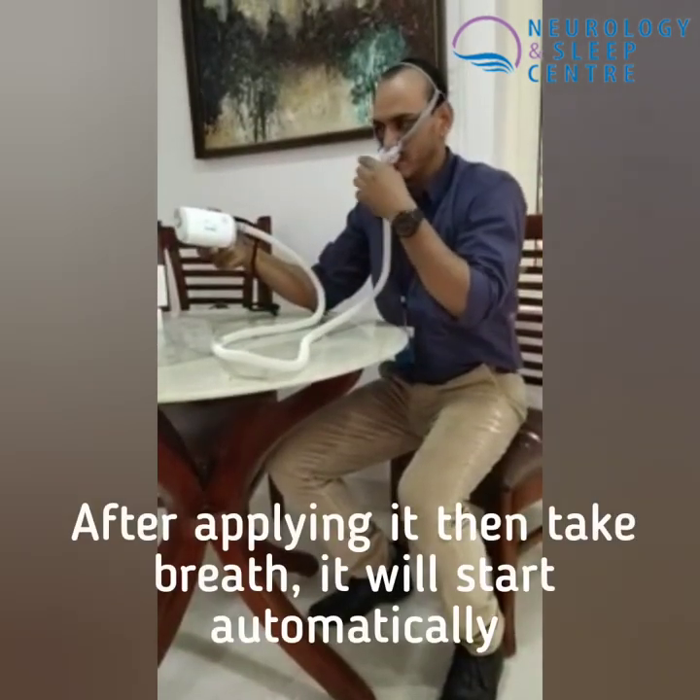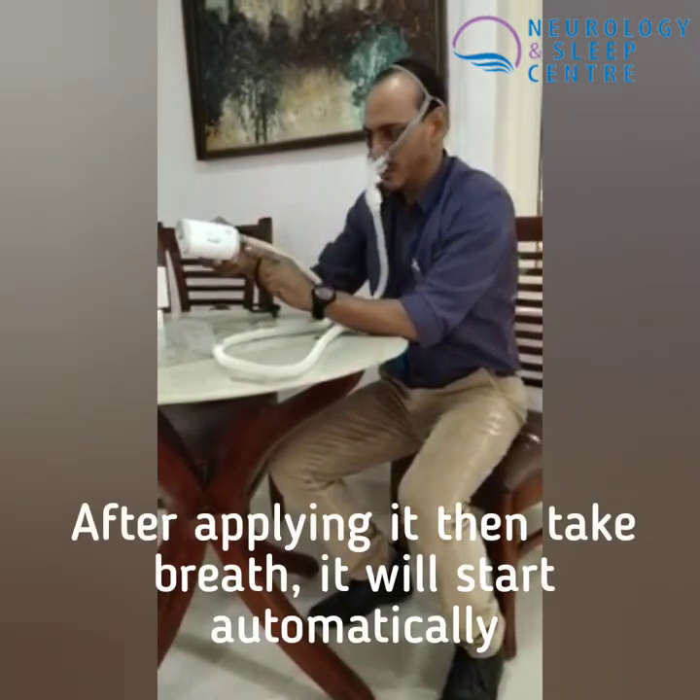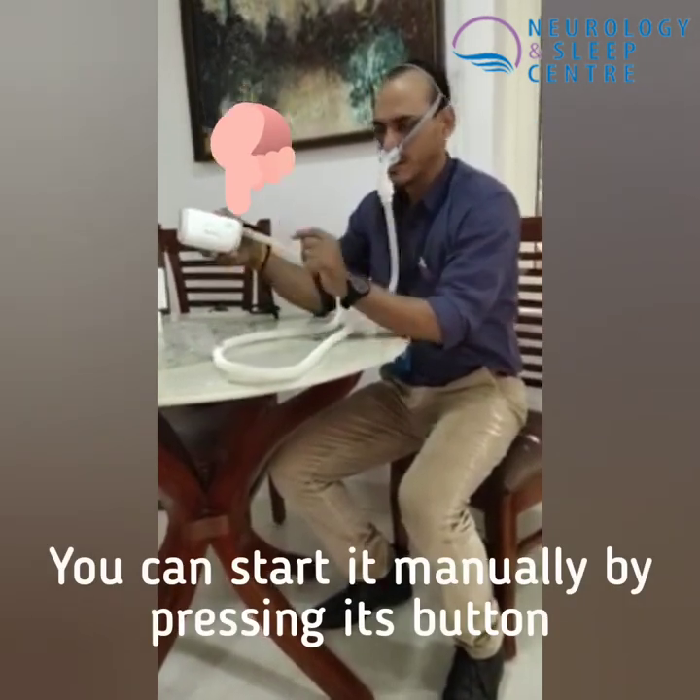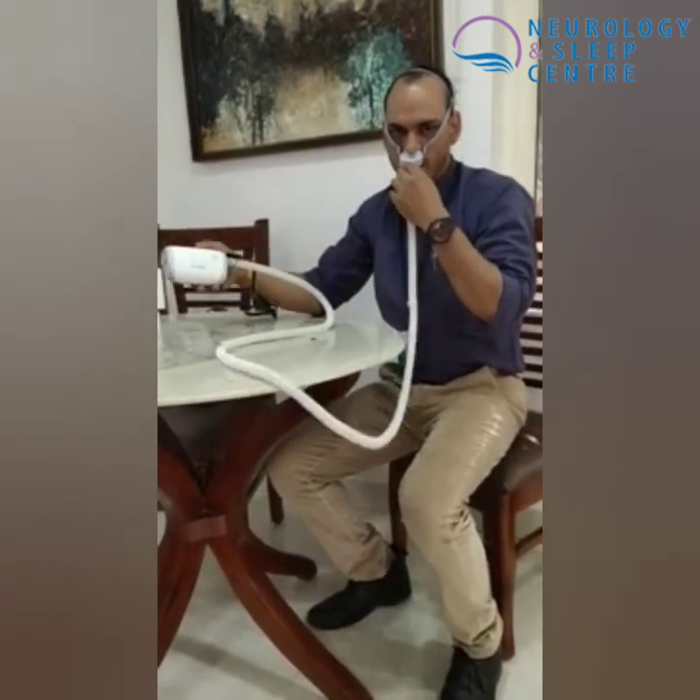The material is functional. When it comes to using the mask, the first step is to start the device. You can start it using the button here, and you can start it from here as well. Now it's on and the device has power.